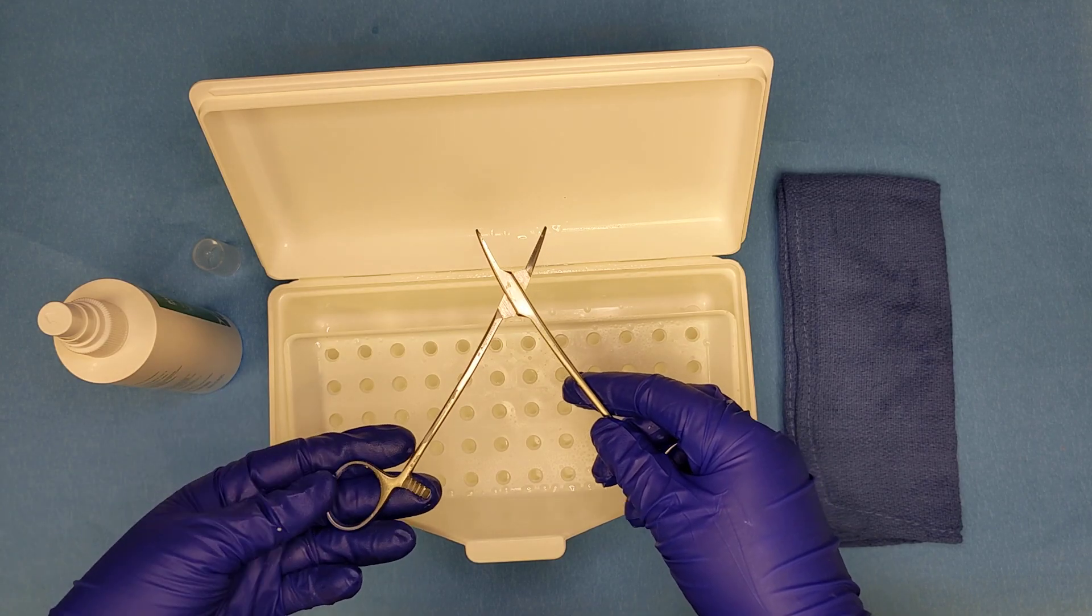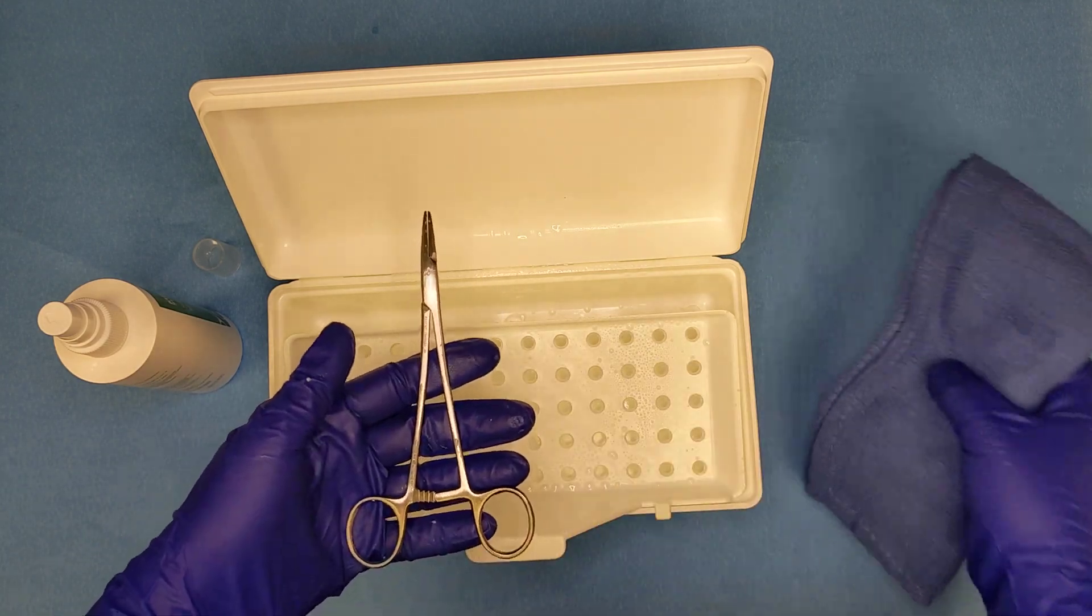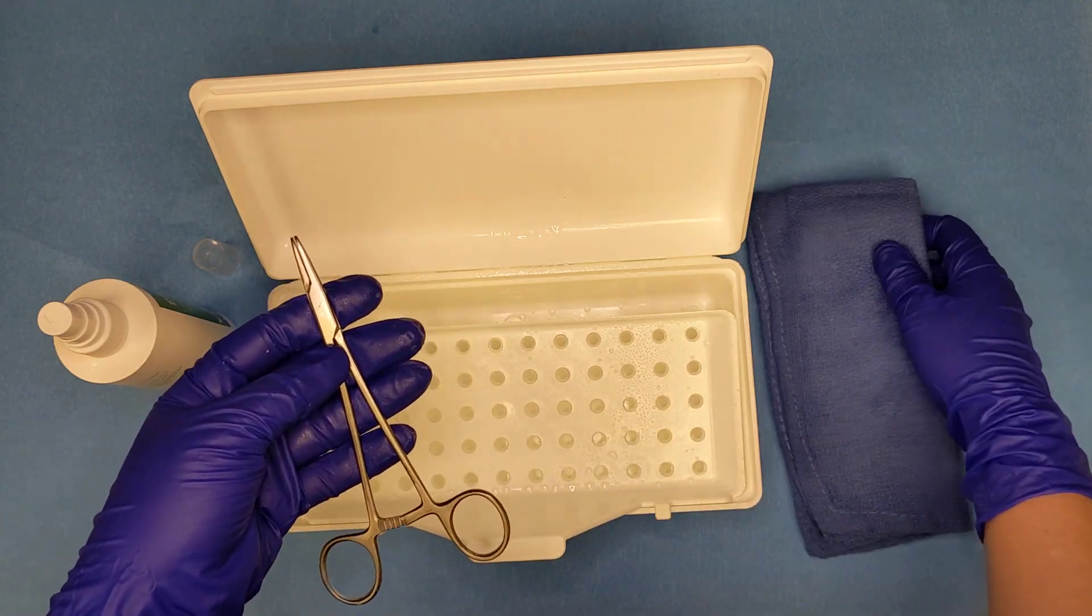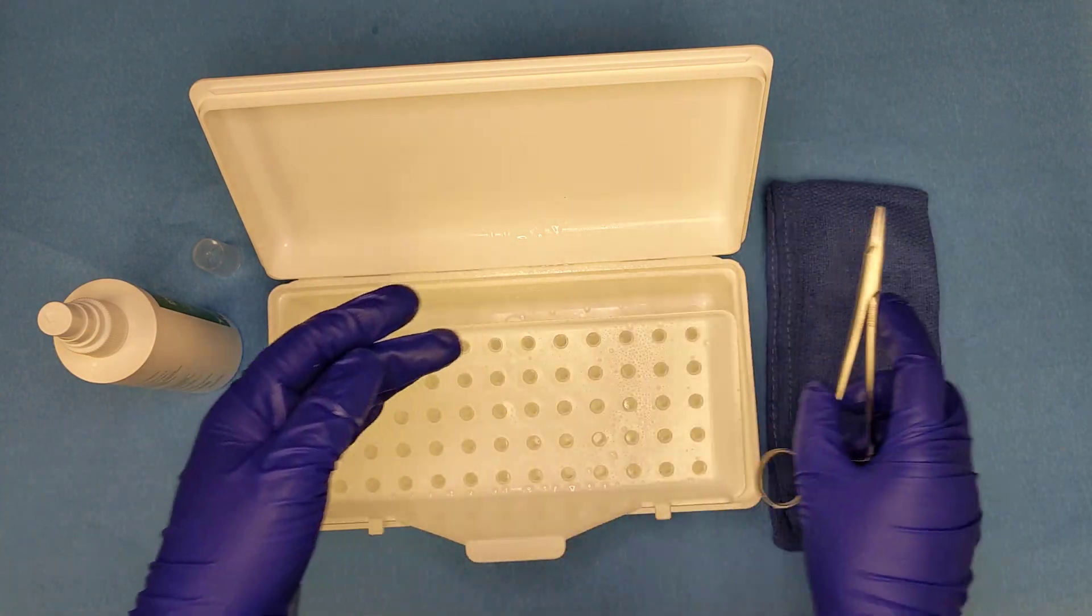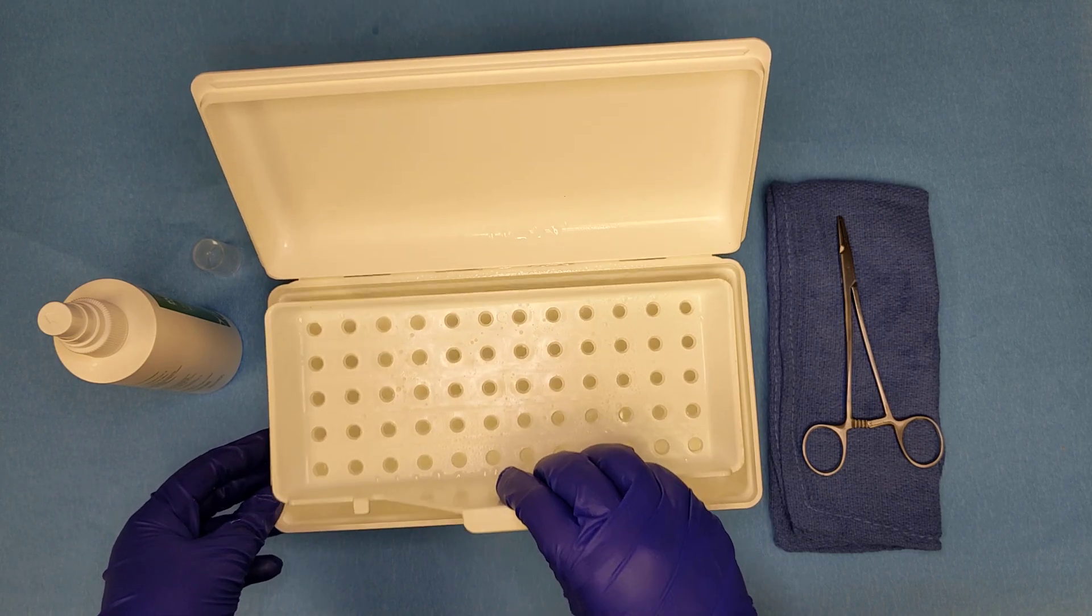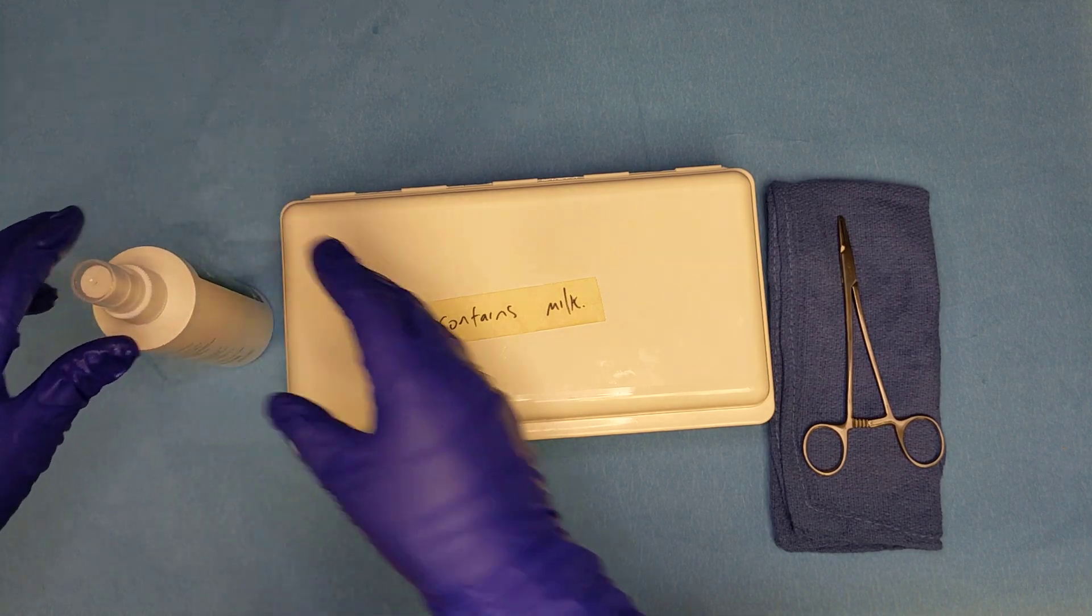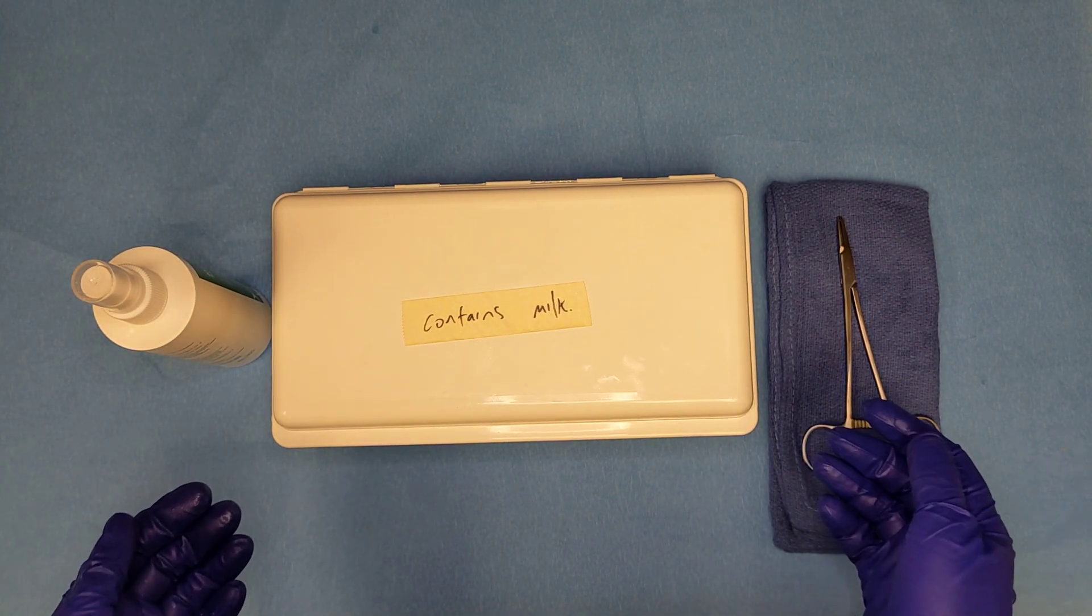If there happens to be any excess lubricant, we can use our soft cloth to wipe off the instrument, although the instructions on the bottle say we don't need to. Then we're going to reassemble our station, and that is how to manually lubricate an instrument.